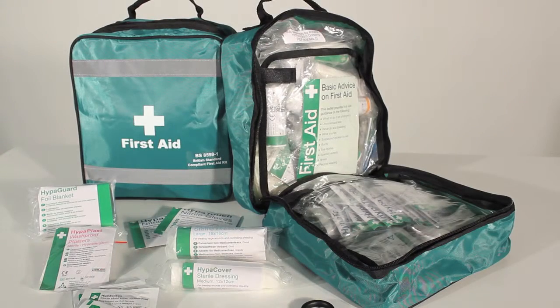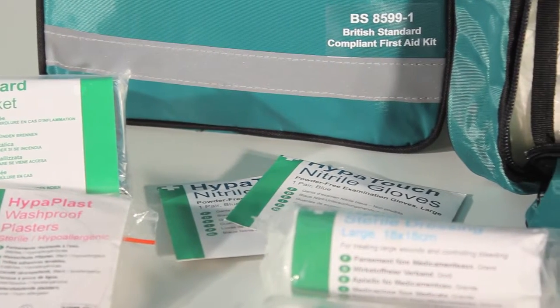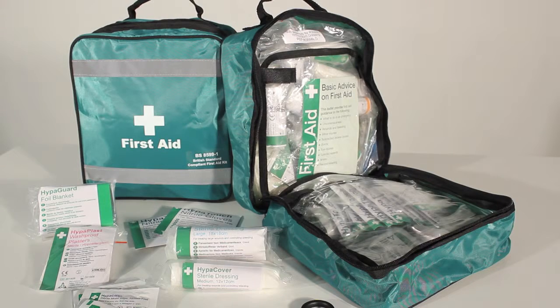The British Standard Compliant First Aid Grab Bag is a BS8599 compliant, lightweight and portable kit. The first aid kit comes fully stocked and the items can be organised and prioritised in the nylon contents holders. The first aid kit can be opened out fully to allow easy viewing and access to the products needed.